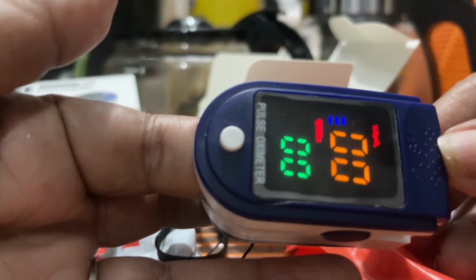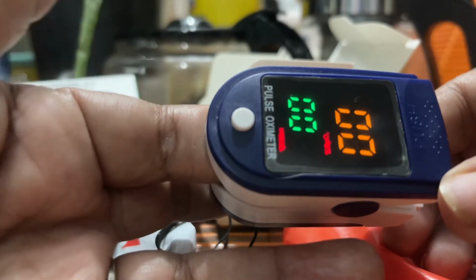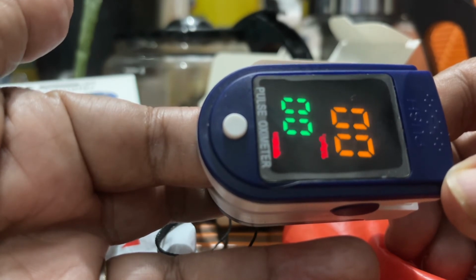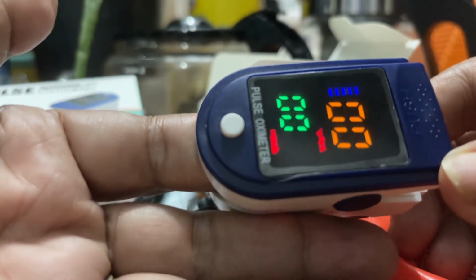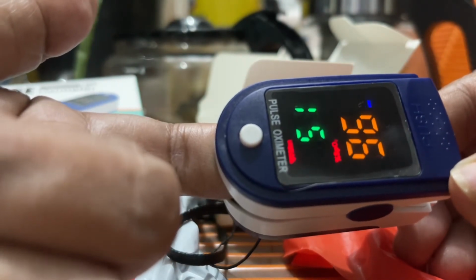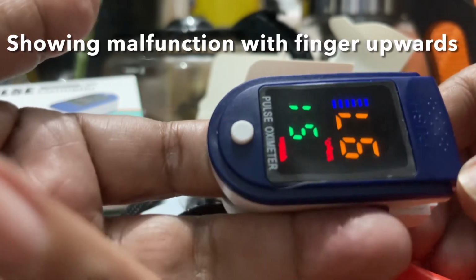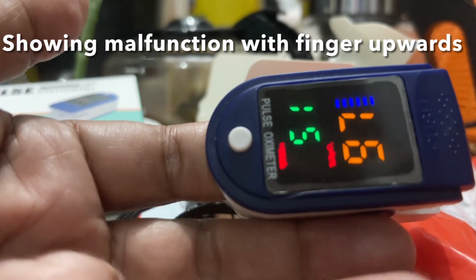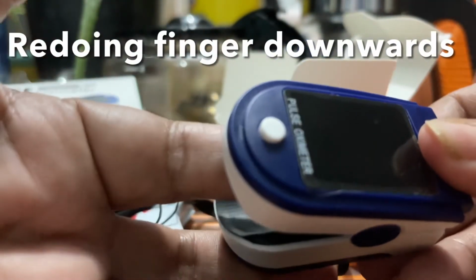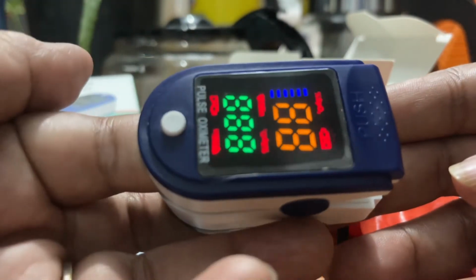It assesses how well a new lung medication is working. It evaluates how a ventilator is working. It monitors oxygen levels during or after surgical procedures that require sedation. It determines how effective supplemental oxygen therapy is, especially when treatment is new. It assesses the individual's ability to tolerate increased physical activity, and it evaluates whether an individual momentarily stops breathing while sleeping, like in a case of sleep apnea during a sleep study.